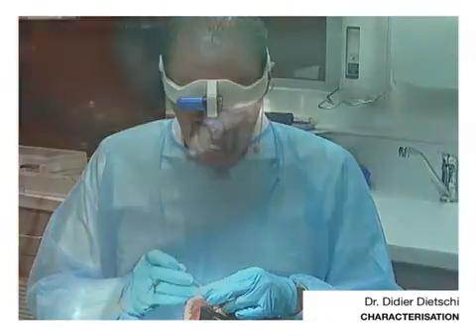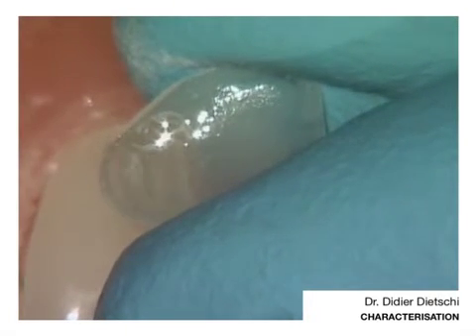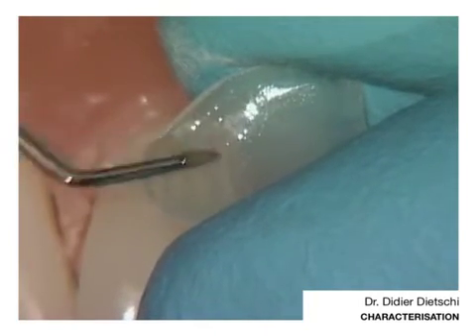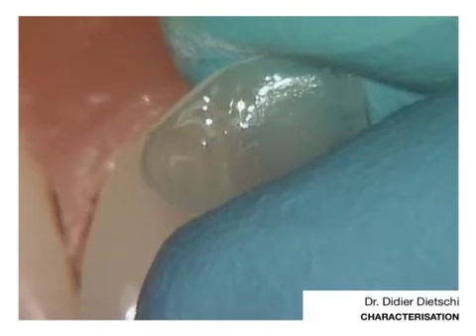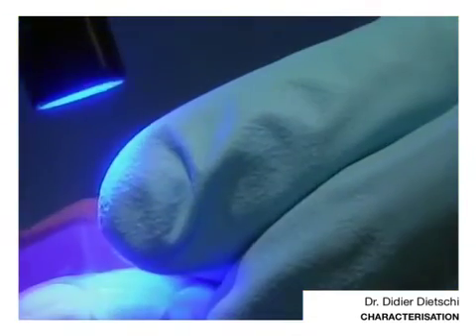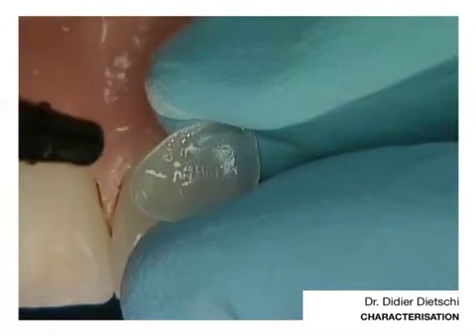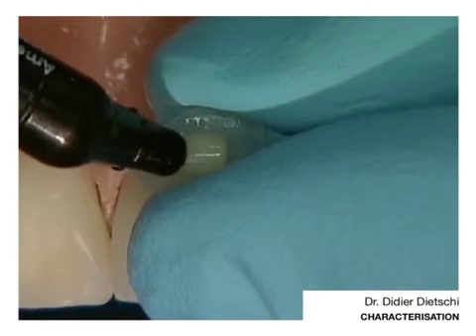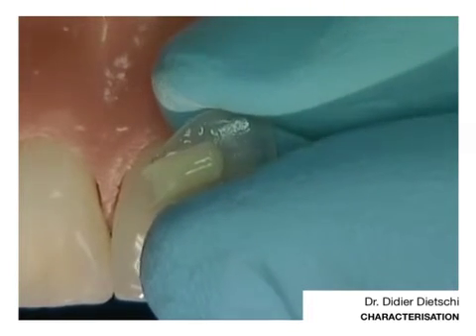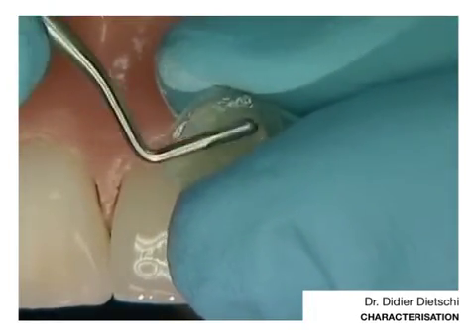We will light cure once again and I hope I haven't exaggerated this characterization. So now I am ready to go and inject a little bit of material. And of course this will give the veneer a lot more color, so you will see that it will look very different from the previous one.